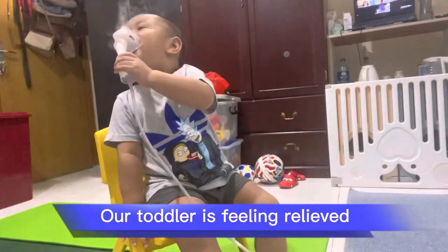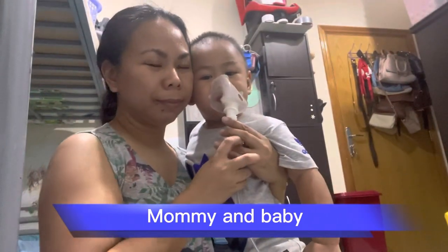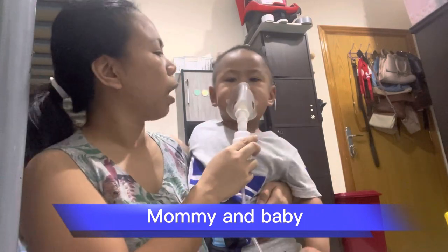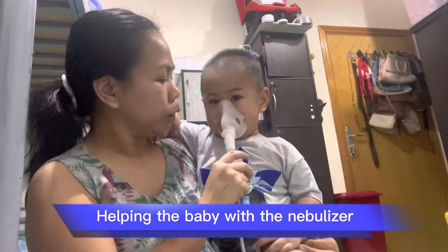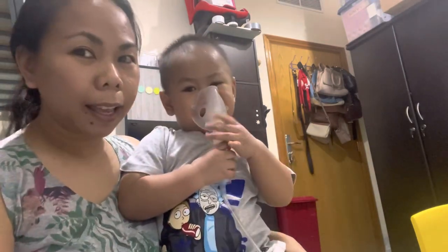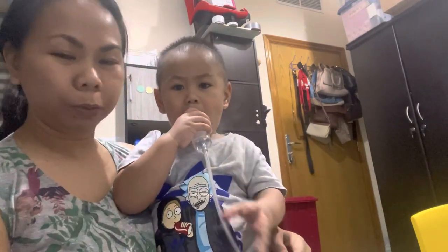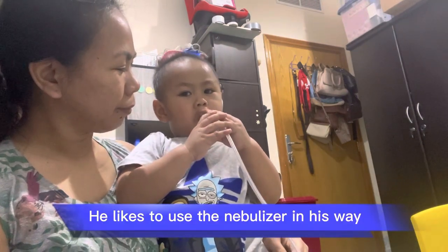Our toddler is feeling relieved. Mommy and baby, helping the baby with the nebulizer. He likes to use the nebulizer in his own way.